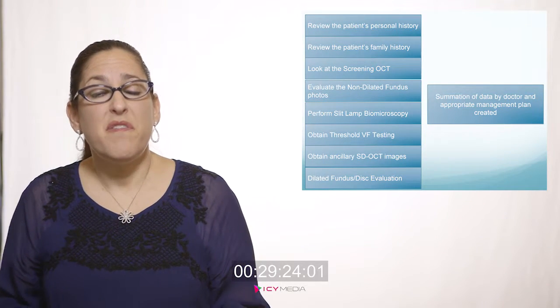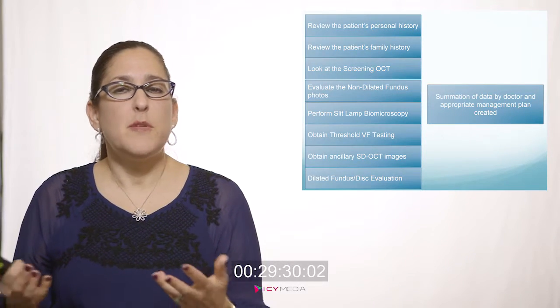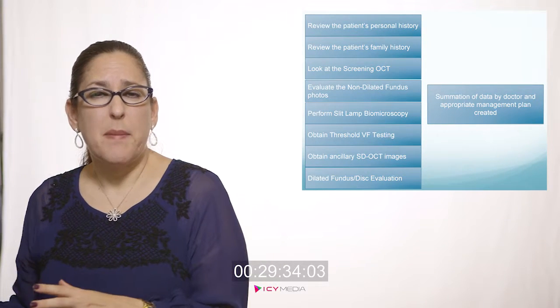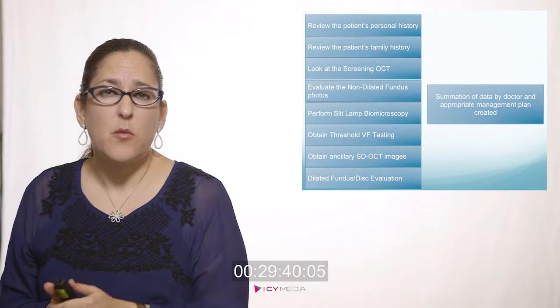We got a screening OCT on a patient that really looked pretty normal based on stereo photos, we found that the GCC was abnormal in one eye, and that corresponded with a functional defect. That might have been something that we wouldn't have done anything with if we were to look at that patient without supplementary testing. So these instruments helped us pick up a lesion much earlier than we would have.